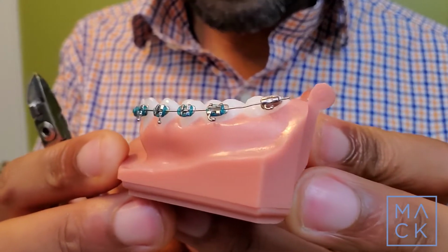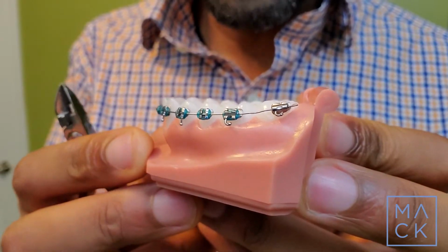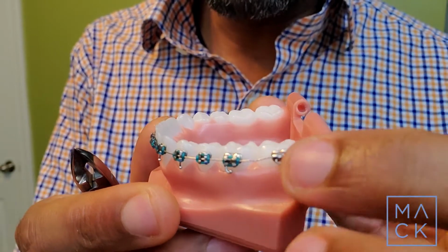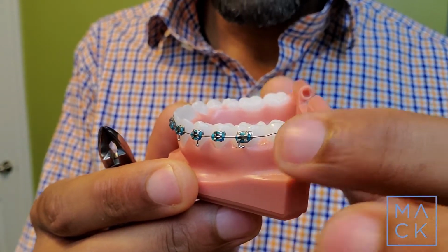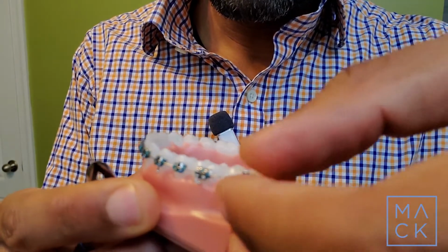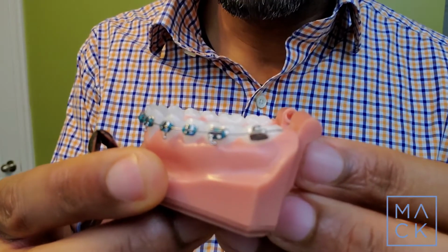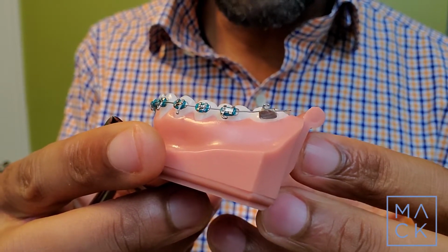The last technique I want to show you is when you have a wire that's loose all the way in the back. What's happened here is you've got a bracket that's loose. This bracket is flopping around and sometimes it can get flipped over, like this. When it's flipped over upside down, it's really irritating to your lips and cheek.